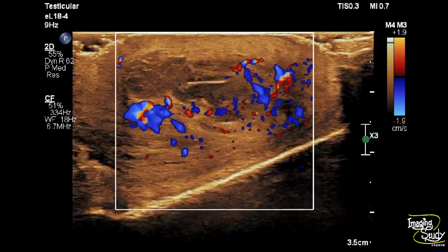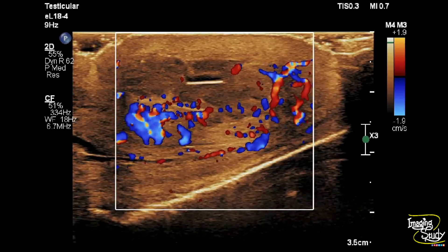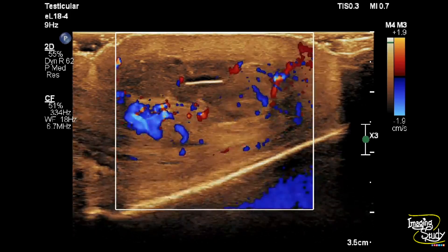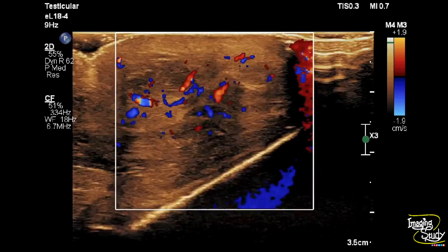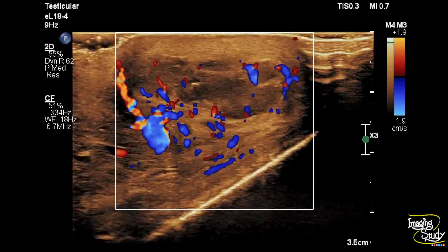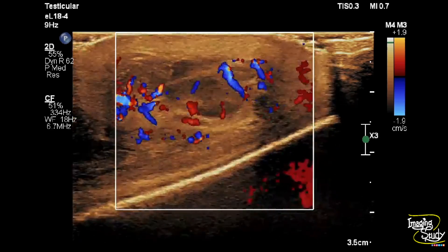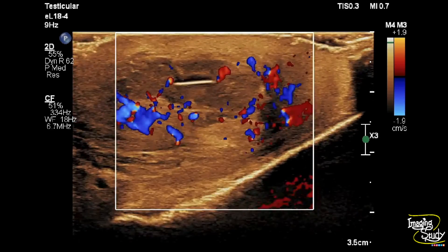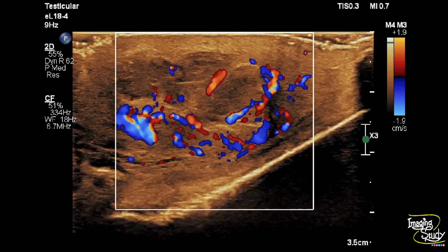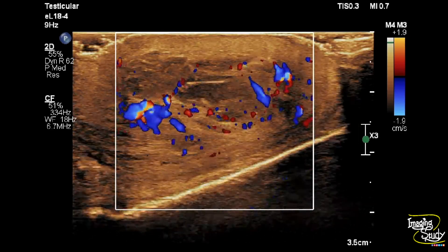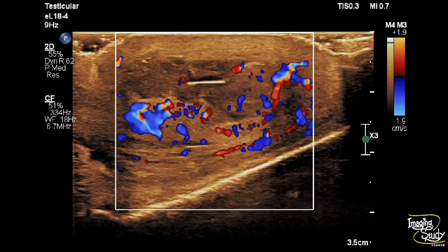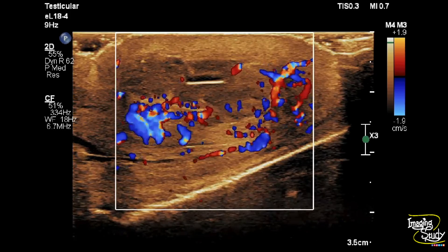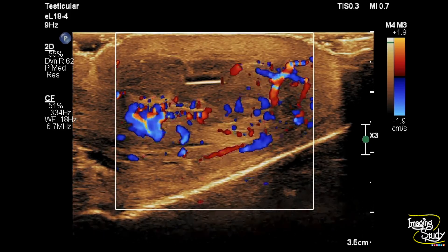Usually wood and glass particles show this type of sonological features. Unfortunately our patient didn't give any history of trauma, but in our practice we commonly see patients try to hide history regarding genital injuries.